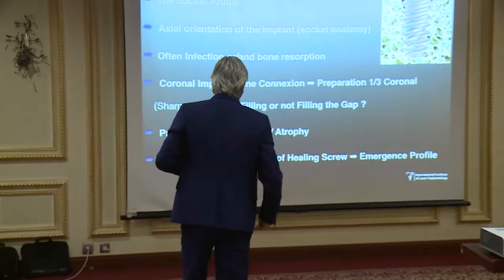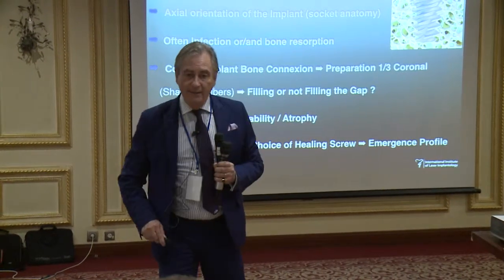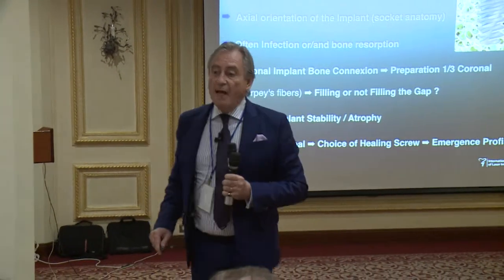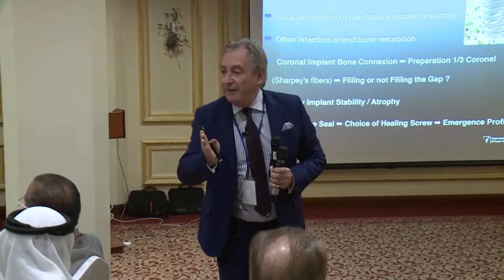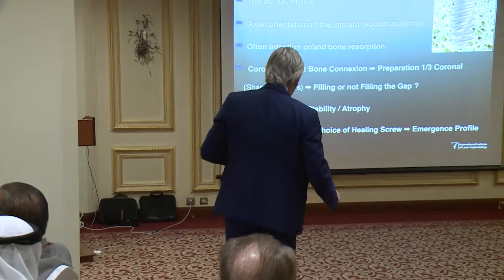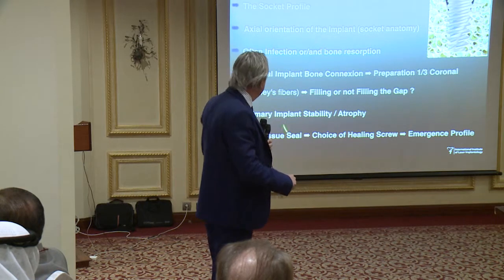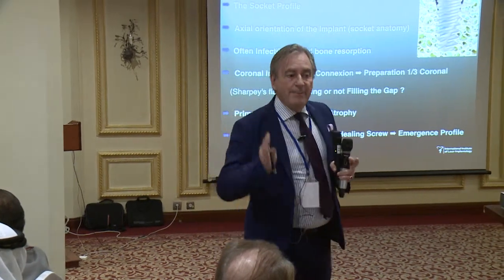And very often, because of this socket profile, you're facing a problem of primary stability with respect to the atrophic shape. And the other problem we're all facing is this gap.